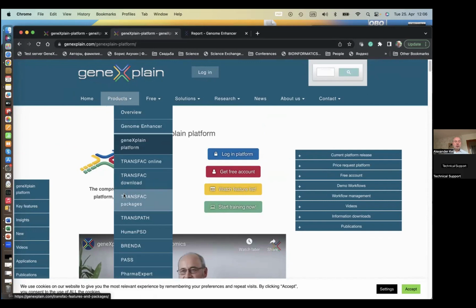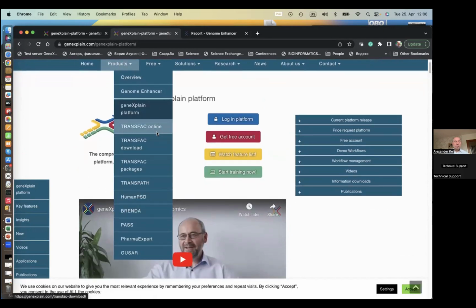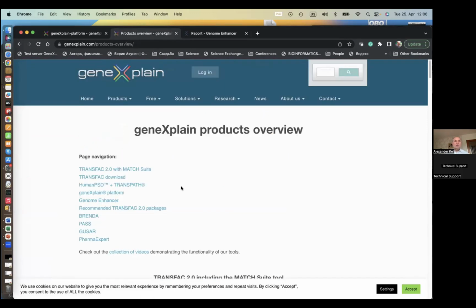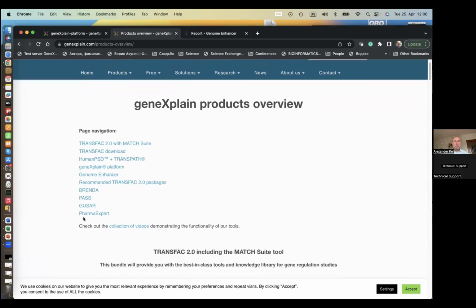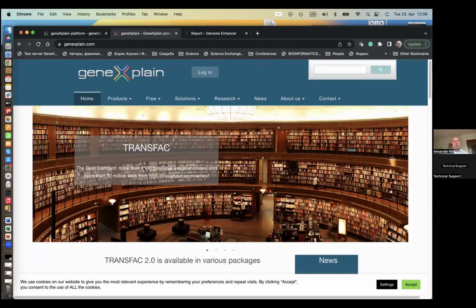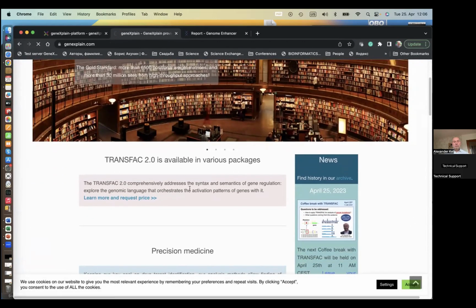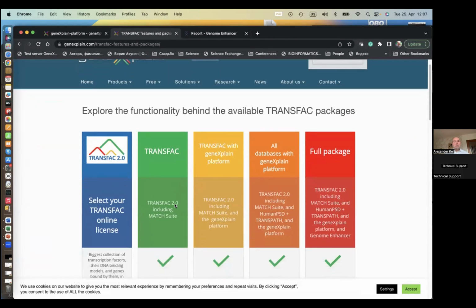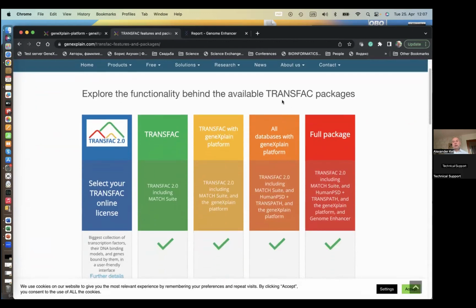All right, so let me go through our products. You see our list of products. It looks a bit complicated, maybe, but actually we have an easy navigation, which is the big table, which talks about almost all our products. We call it the TRANSFAC packages.